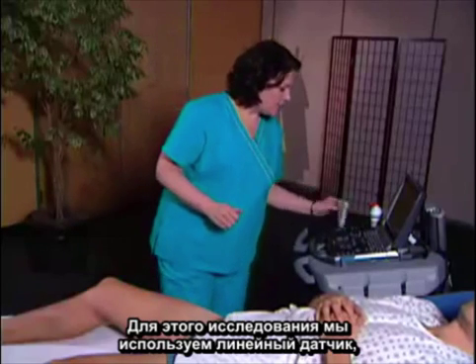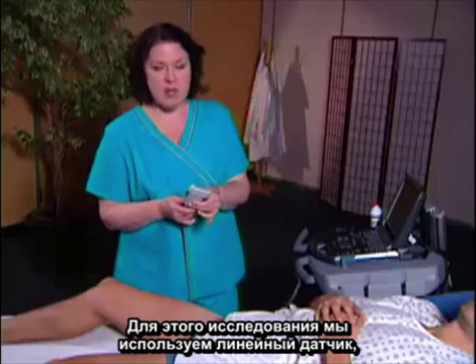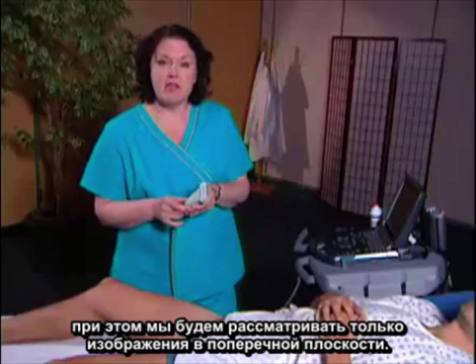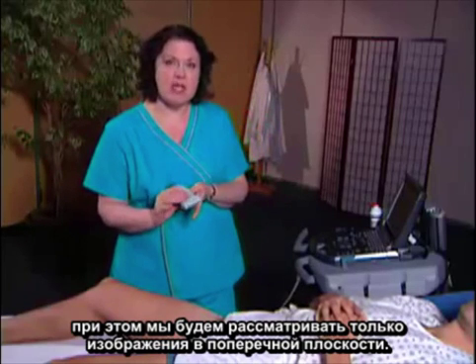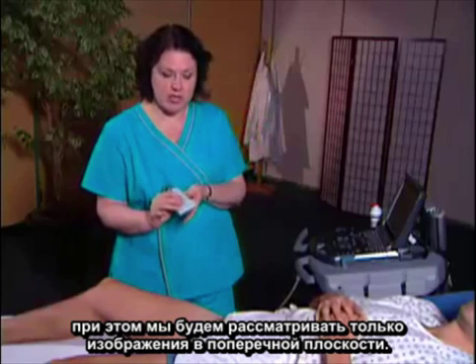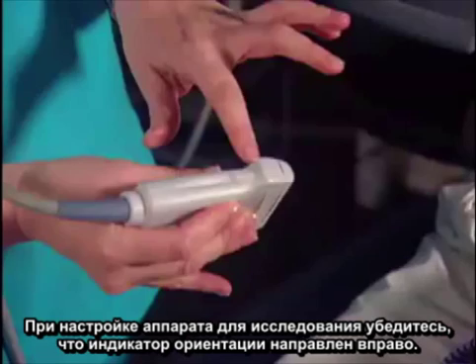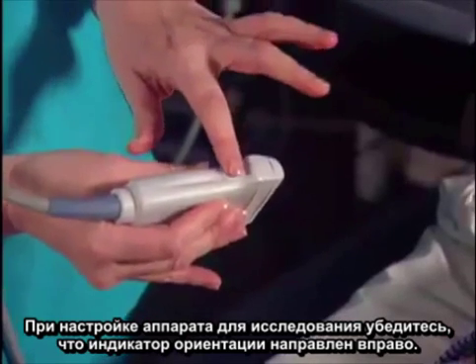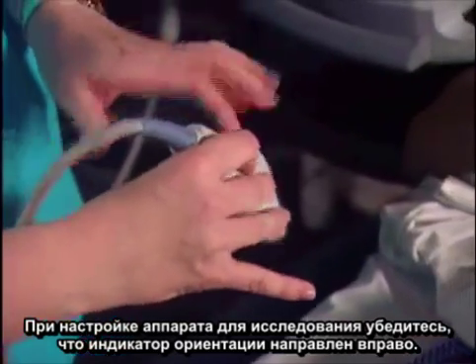We're going to use a linear transducer for this examination, and the views that we do for this exam will just be in a transverse orientation only. When setting up for this examination, make sure the orientation marker is to the right.